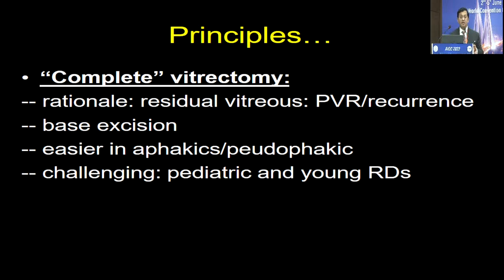The other place where complete vitrectomy is a challenge is in pediatric and young RDs, young patients with RDs, because over there you have a lot of vitreous, and that vitreous is firmly adherent to the retina.